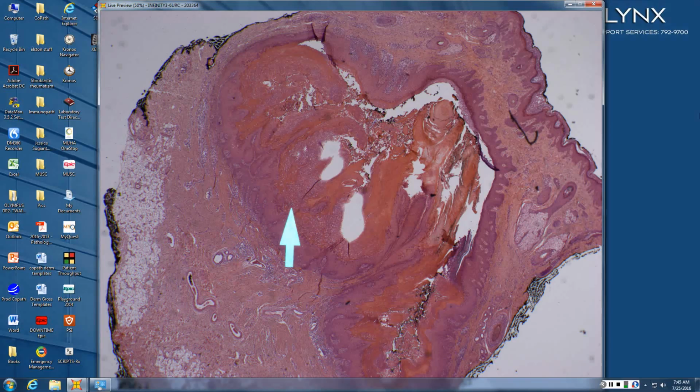So, Nicole, if this weren't down in a cyst, but were on the surface, what kind of thing? Verrucous. Sounds like a wart, right? So is there any kind of a wart cyst? There is. There is a verrucous cyst. A verrucous cyst, or cystic papilloma, those are both names for it, is basically you get HPV in one of two structures, either a hair follicle or an eccrine duct. And it turns into a cystic wart. Any portion of it looks like a wart.